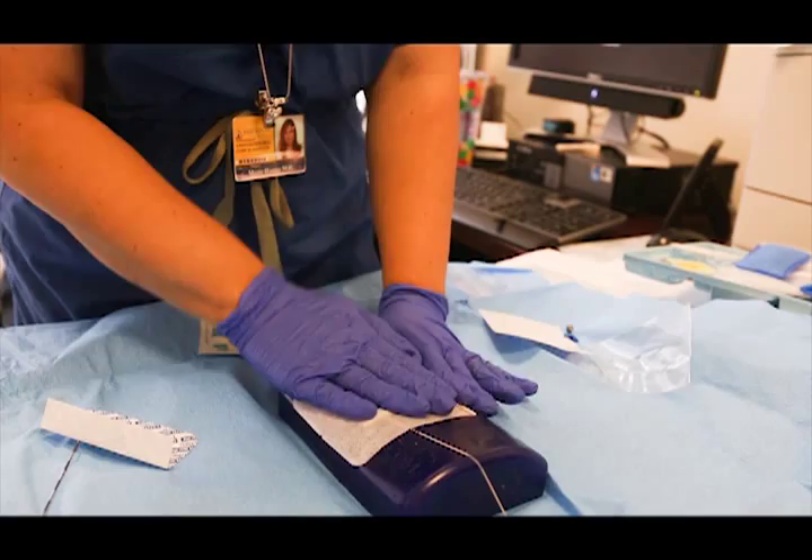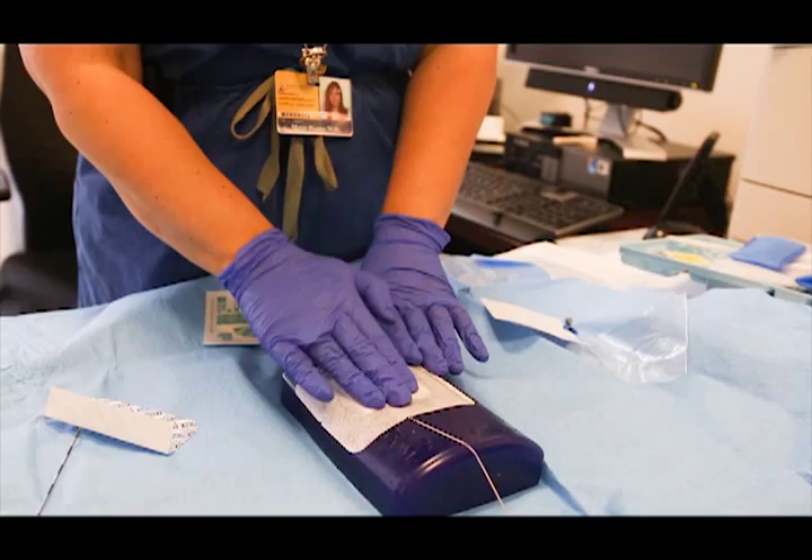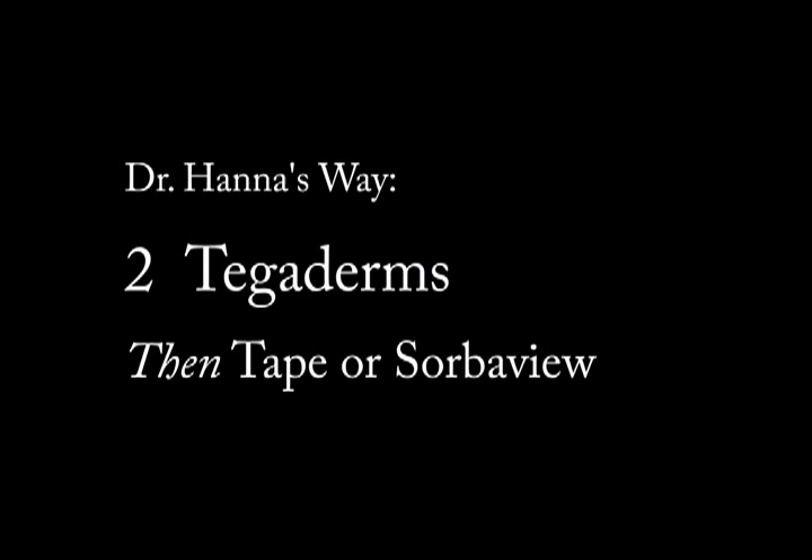This is how most people apply the SORB-A-View. Look at the bubbles underneath it — even if you place it tight, there are still going to be air bubbles. This is wrong. We don't want to do this.